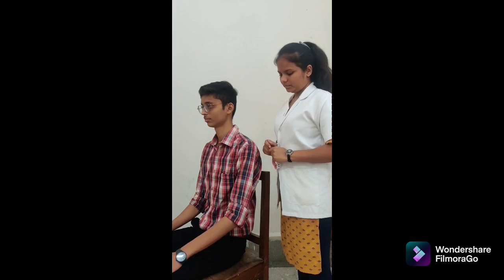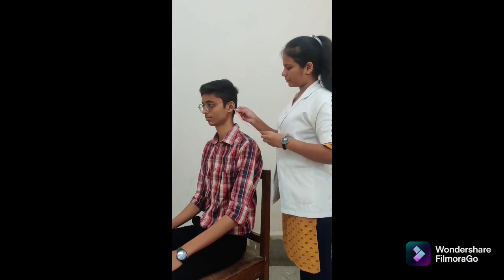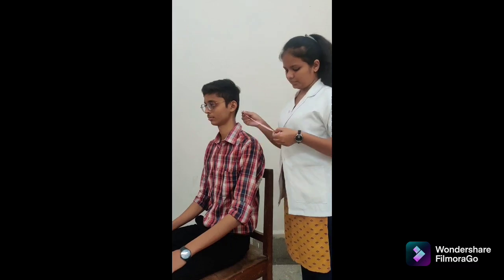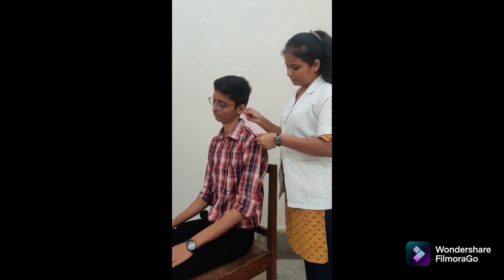We are going to perform cervical lateral flexion with tape. Patient position: high seating with thoracic and lumbar spine supported by back of chair. Tape alignment: place marks on the subject's mastoid process and on the lateral tip of the acromion process, and measure the distance. Normal range: 10.7 to 12.9 cm. Instruction: move the head into lateral flexion while keeping the trunk straight. Measure the distance between the two marks at the end of the motion.